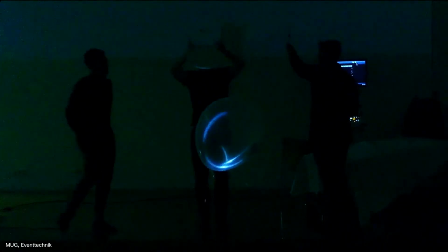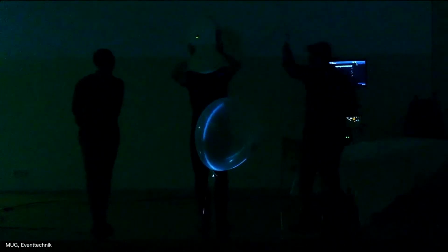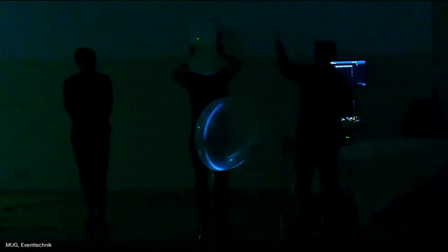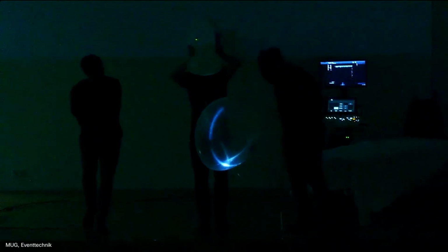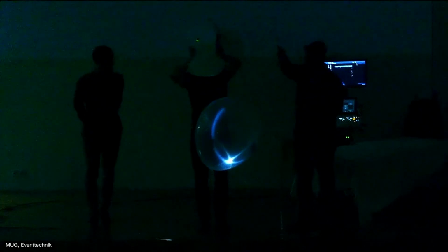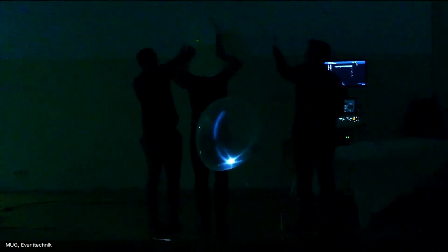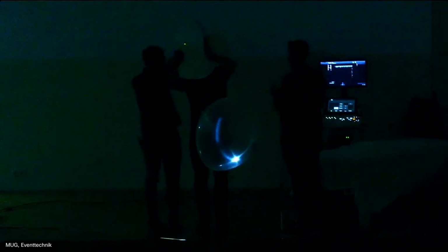Okay, stop. Now we ask you to do exactly in this position a slow rotation clockwise. A rotation clockwise. Yeah, I'm thinking about the clock. To the right. Okay, stop. Okay. Let's do a little fanning movement to the other direction. Very, very slow. Stop. A little bit more.